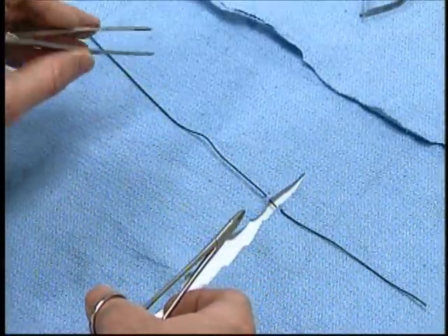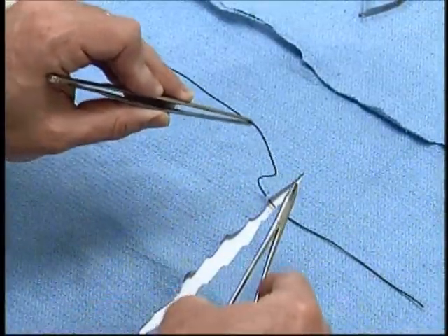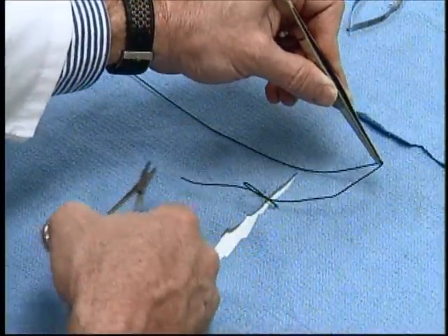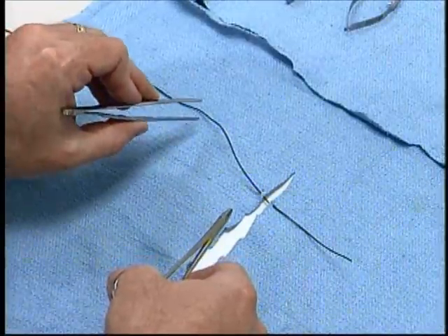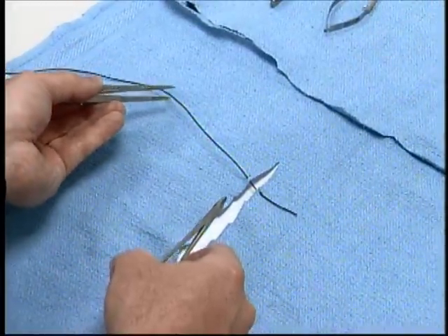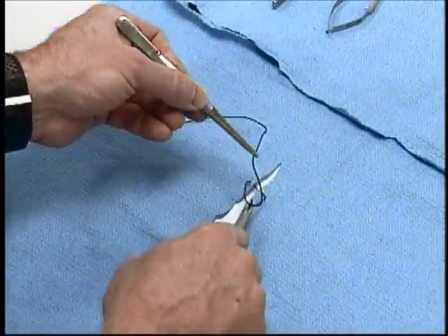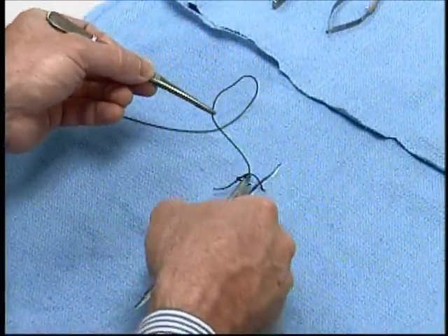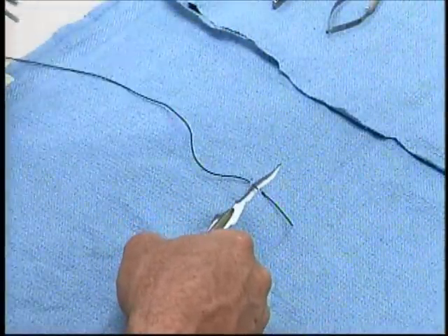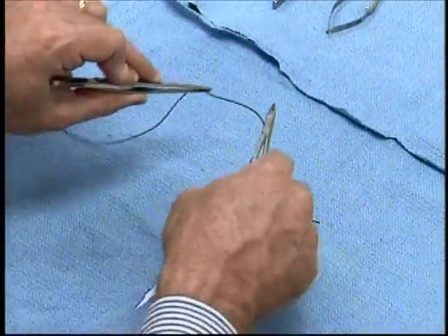Normally we approach the suture with the left hand pronated in order to make a loop. This creates a nice loop so that it will fold easily around the needle holder and lay down flat. Notice the left hand was pronated, or palm down, to make that loop. If the hand is supinated and grabs the suture in that way the knot can be made, but it's not as easy as when you begin with the hand in a pronated fashion — it's just a more natural action.